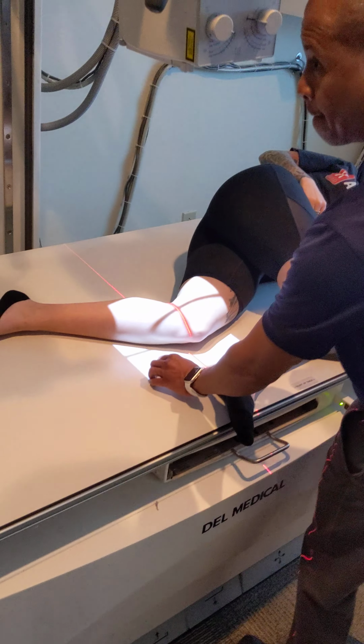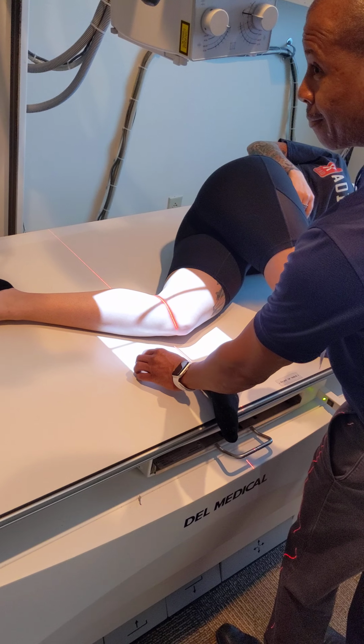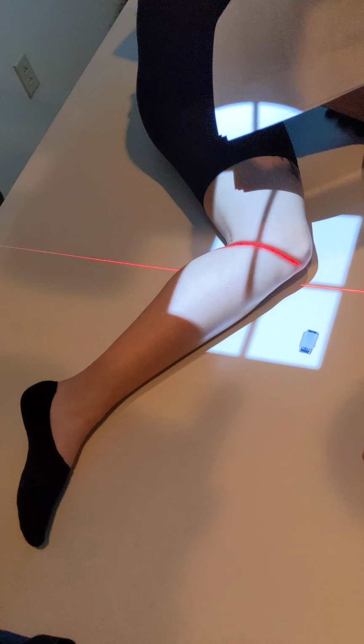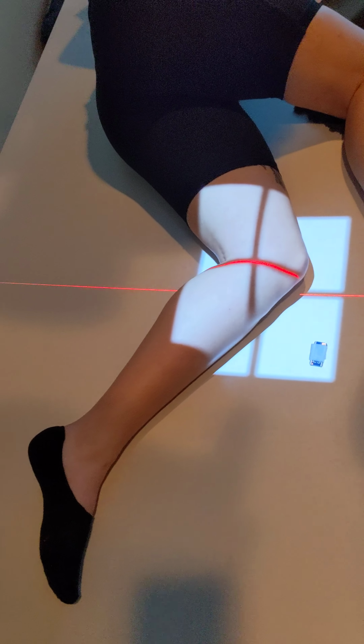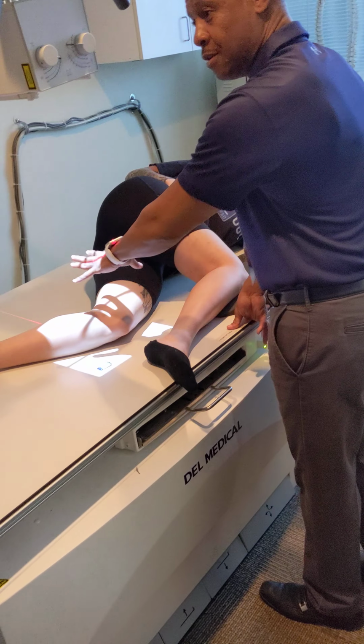Now, would we bring the collimation in or no? Why? Because we're focusing on the knee only? This is the knee. Yeah. We don't want to get the back close to you, so we don't want to get it. Just checking. Correct. So leave it just like this.